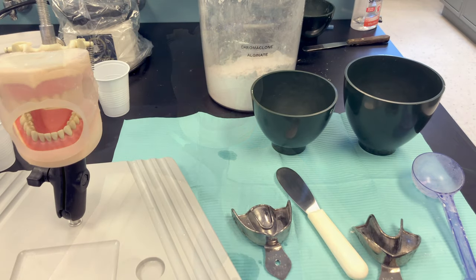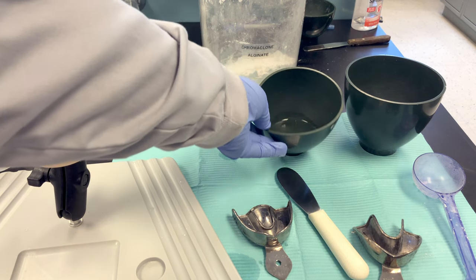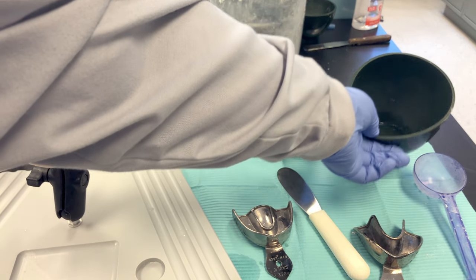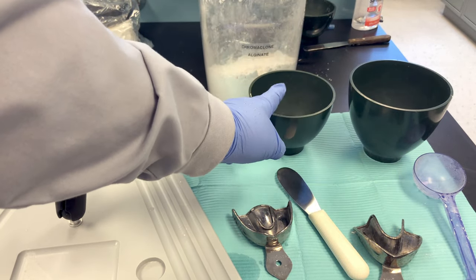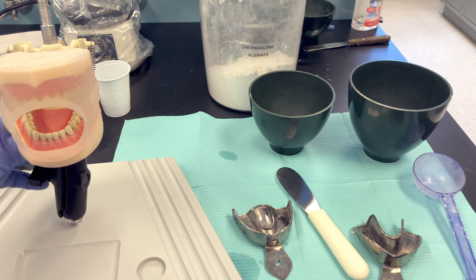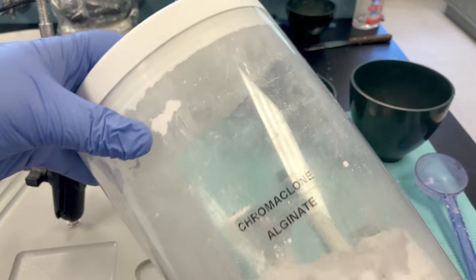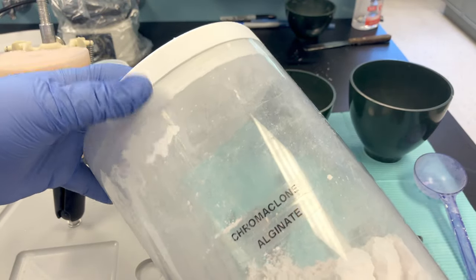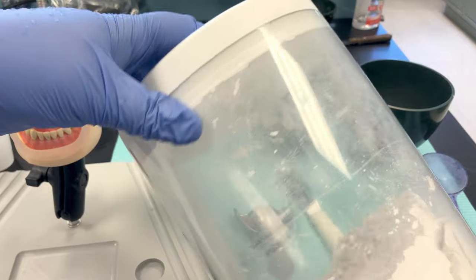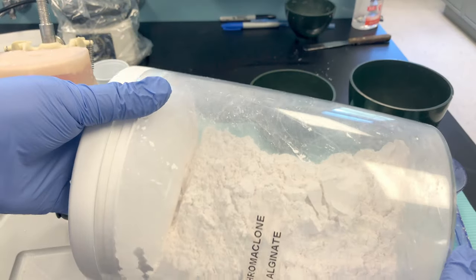Once your trays are sized properly, we can do our mixing. I've already measured out my 40 milliliters of water. For Chroma Clone you can go up to 45 milliliters, which gives a looser, runnier mix — helpful when first starting out. Chroma Clone naturally mixes to a thicker consistency for patient comfort so it doesn't run to the back of the throat, but 40 milliliters is the correct measurement.